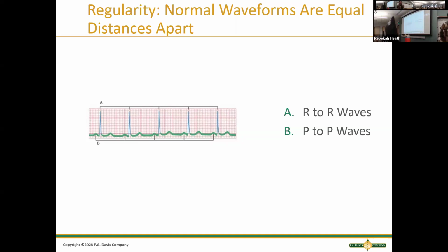I want you guys to go over to, let's look at atrial flutter. So you should have one, I think it's on the second page, that says atrial flutter. And I want you to measure the distance between the QRS complexes. So measure two points from that first QRS complex to the second, and then march that out and see if it's regular.